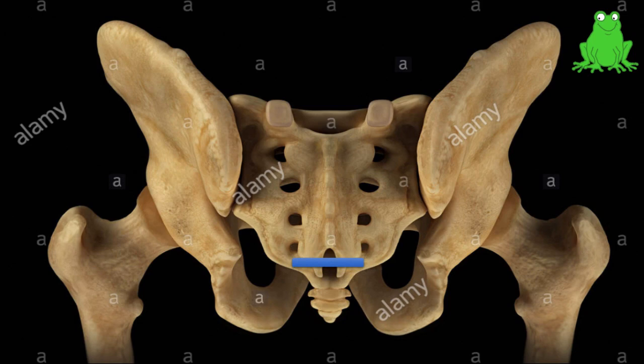At this point, step two is to rotate the probe to the sagittal or longitudinal plane so that we can find the sacrococcygeal membrane and proceed with the needle. We can visualize an in-plane approach for the needle and see the needle piercing the sacrococcygeal membrane and entering into the epidural space.